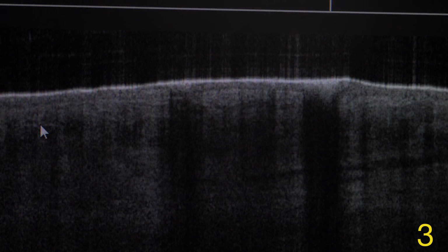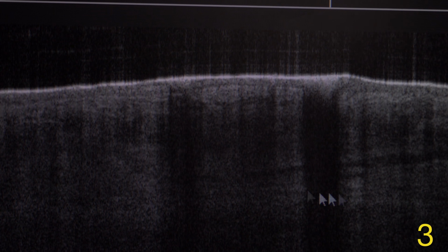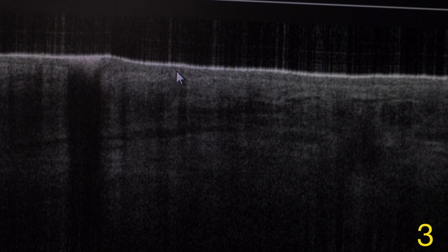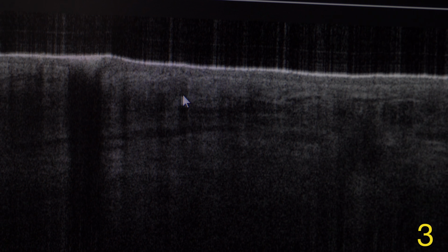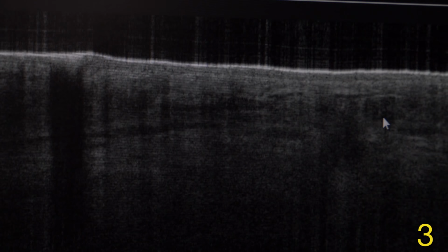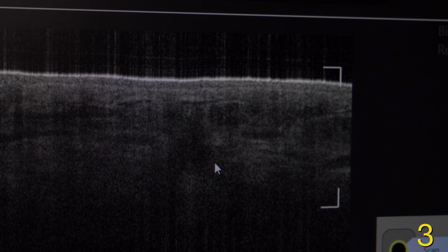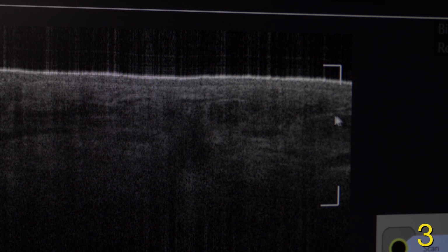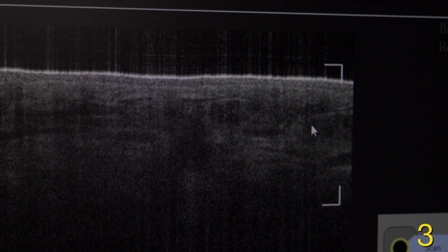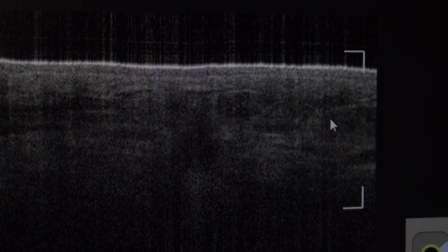It's, I think, a micronodular cystic subtype here also, but we can still see some nodules on the right hand, which should be healthy skin too, because we can see a lesion here and also here, and this is why I decided I want to add a safety margin to cut the BCC, hopefully tumor free.